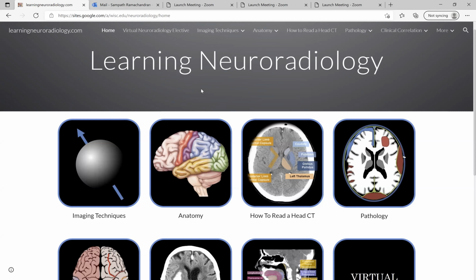We will look at some of the cases we see typically in the ER and beyond. I'm an ER radiologist, so I see a lot of cases in an acute setting like traumas and strokes, and that is my biggest chunk of cases. But we do see other types of cases too, where it's more of a chronic problem in terms of neurologic symptoms. So let me give you a brief description of what CT is like.